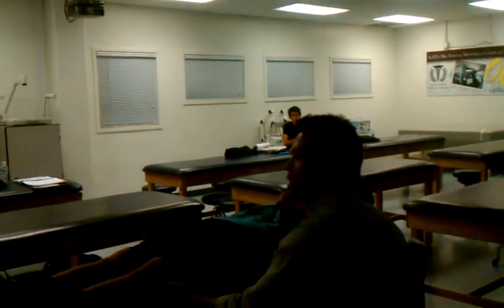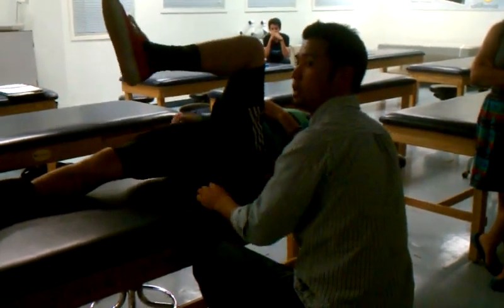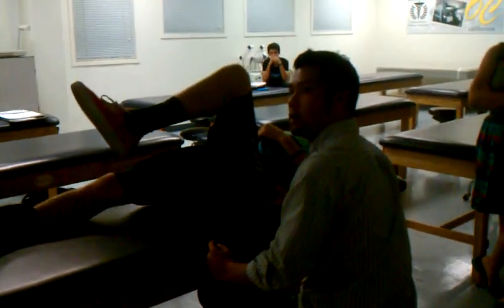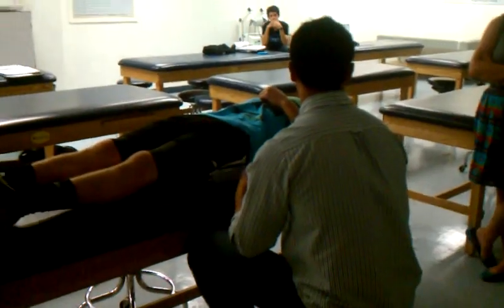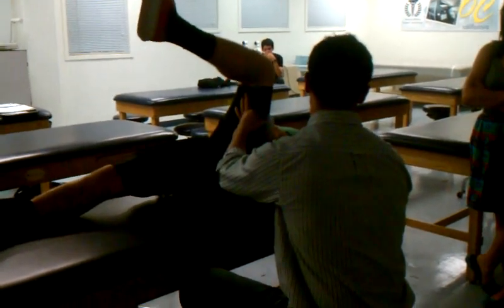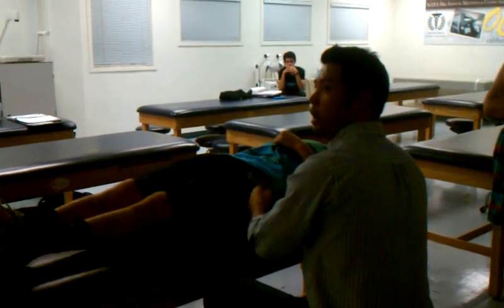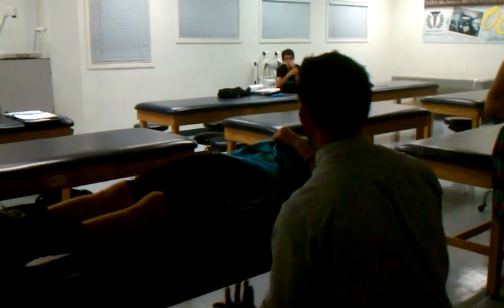If you're measuring hamstring tightness, this is as far as it goes. He's able to go further if you take off the hamstrings — that's true hip flexion, taking off the hamstrings. Do you want to measure it against the hamstring, which limits range of motion, or do you want true motion without soft tissue impediment? Remember: axis is the greater trochanter, stationary arm bisects the trunk, moving arm bisects the femur.